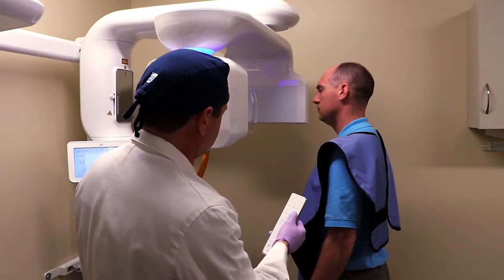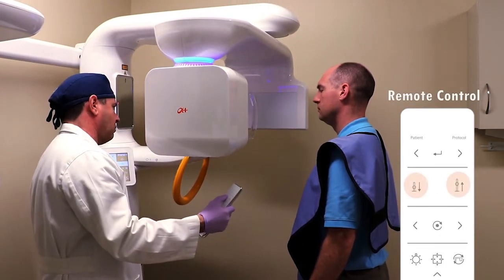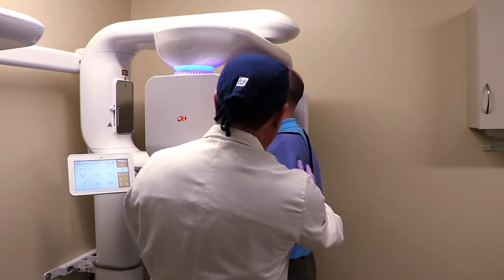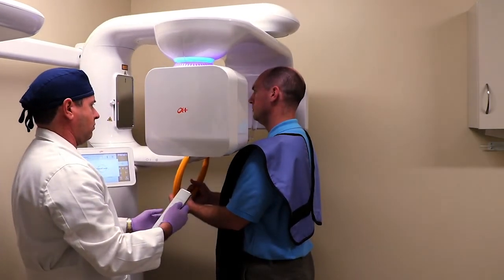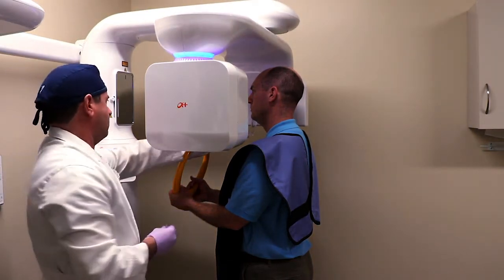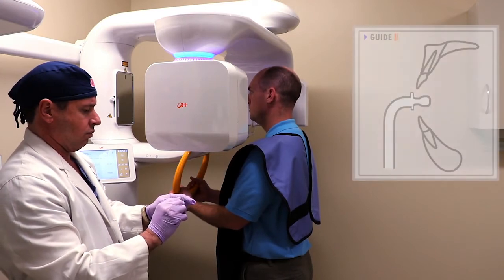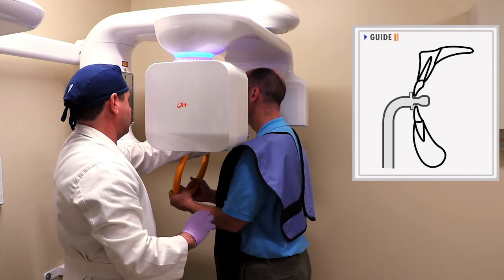Adjust the height using the remote control buttons and guide the patient to the scanner. Instruct the patient to grasp the yellow handle. Place a disposable hygienic cover over the bite stick and instruct the patient to place the anterior teeth on the groove of the bite stick.